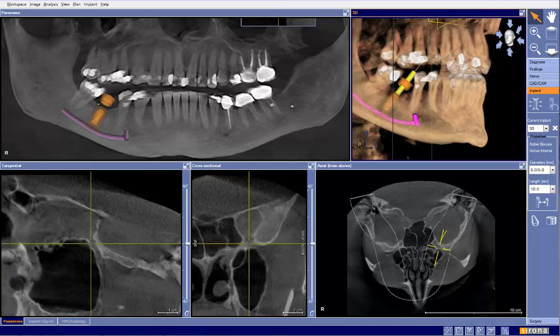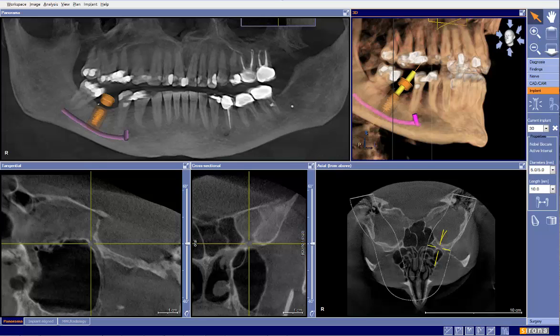We've got another case that's been submitted, and this one has come from an attendee of the Sirona user training. This person is new to cone beam and implant virtual implant planning.